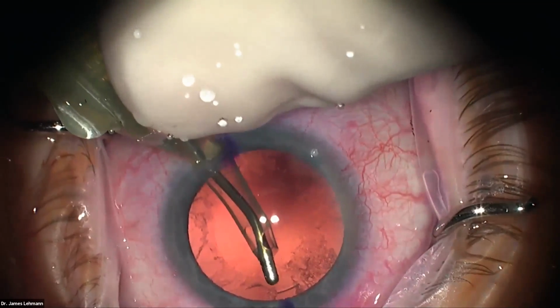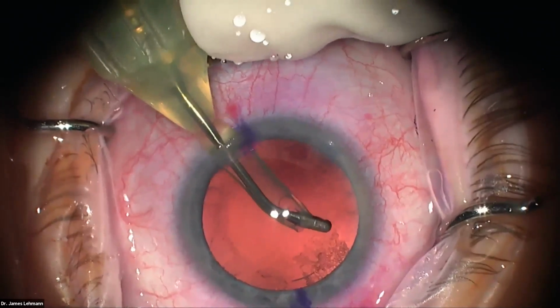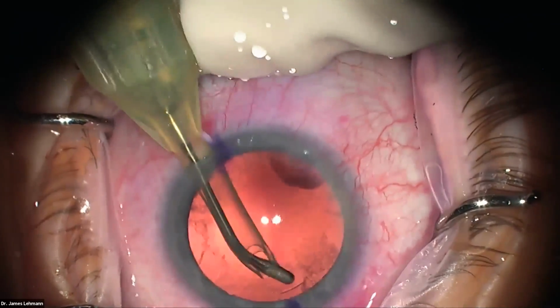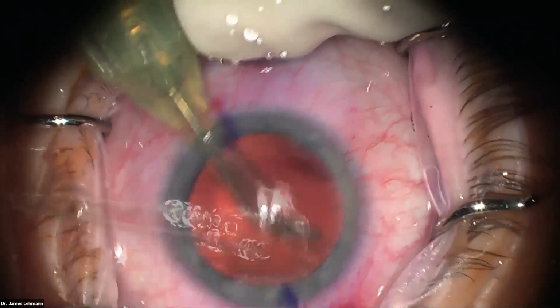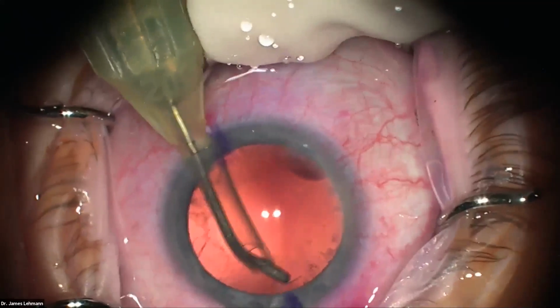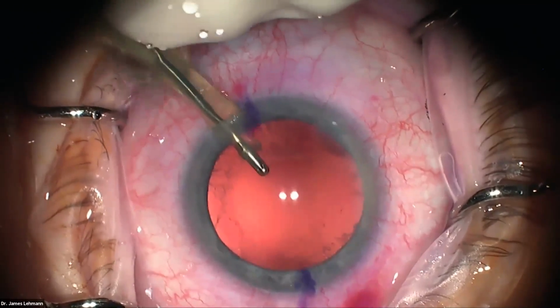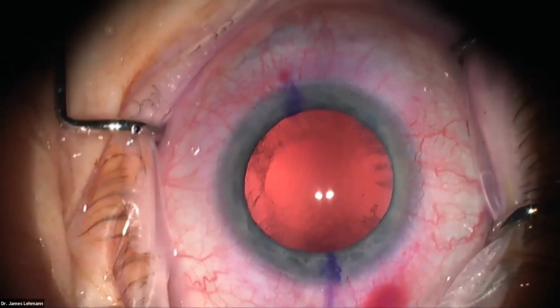I have polish, so I can demonstrate, if you wanted to get some more, you can use the polish, which is low setting here, and you just grab it like that. See how I'm grabbing this? None of it's in the middle there, so it's not really that consequential. Don't really have to spend too much time messing with it. Okay, so remove that. You can see the capsule's clear here in the center.